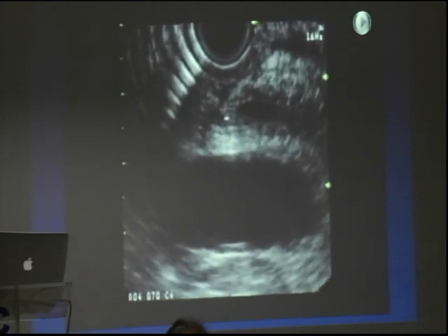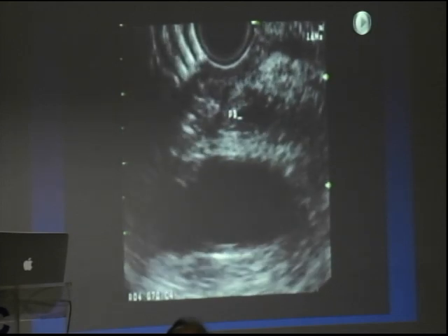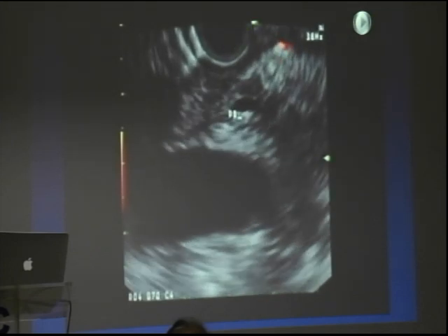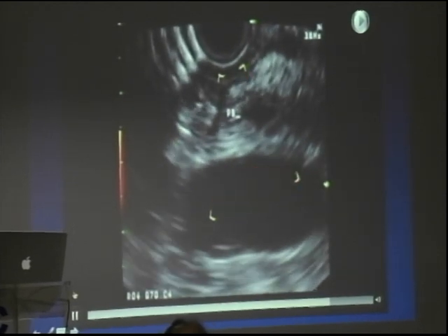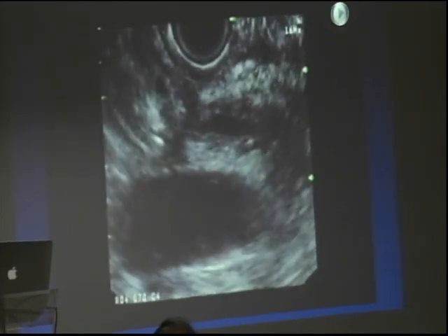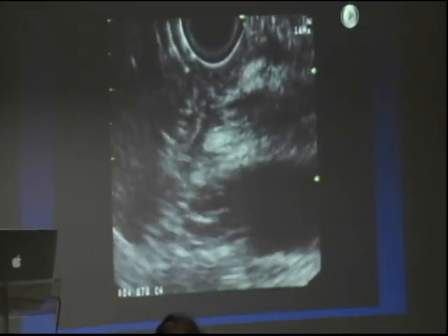One can clearly see the pancreatic duct, which typically comes from deep within the pancreas, whereas the bile duct is seen closer to the duodenum. Color Doppler can be applied to differentiate vascular from non-vascular structures. With further torquing, one can see the bile duct as well.